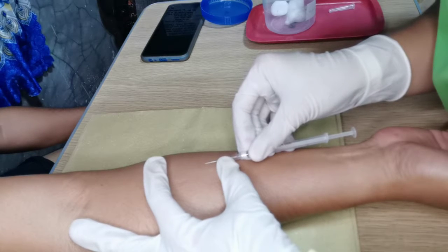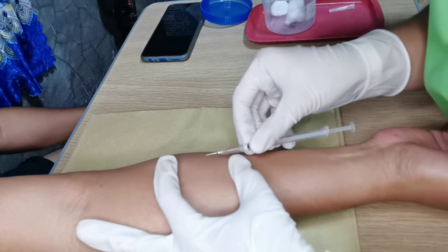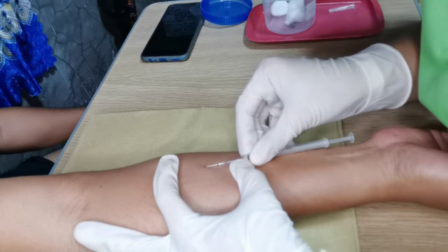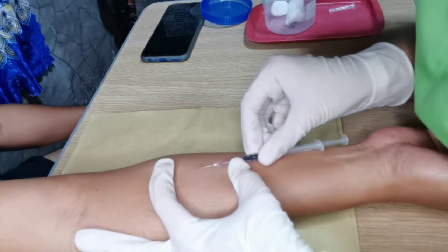Hold the syringe at a 10 to 15 degree angle from the site. Place the needle almost flat against the patient's skin, bevel side up, and insert the needle into the skin so that the point of the needle can be seen through the skin. Insert the needle only about 1/8 inch with the entire bevel under the skin.